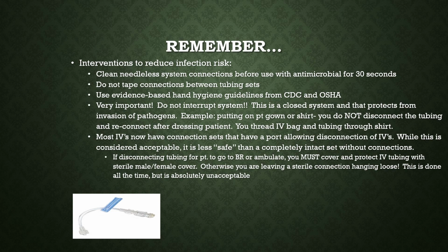But if you must, plug off each end very securely with a nice male-female connector, so that you don't contaminate it. And I always keep those in my pocket for that reason. But ideally, do not disconnect the system. Not what we want to do. Thread them through their gown, or now you all are lucky enough to have the snap gowns. We didn't even have snap gowns, so we had to take their IV through their gown and all that stuff. So you're very fortunate. Please avoid disconnecting when you can, and if you must, then plug off. Use plugs to plug off your IV.